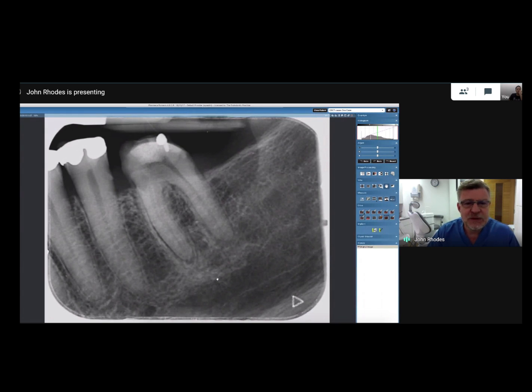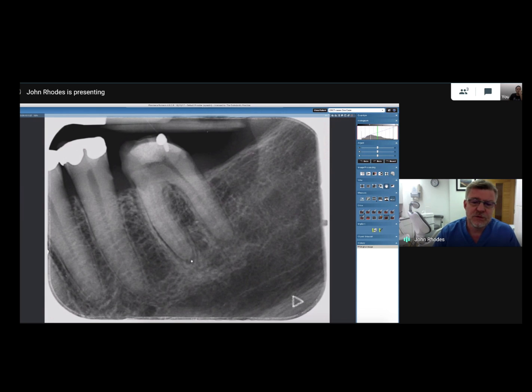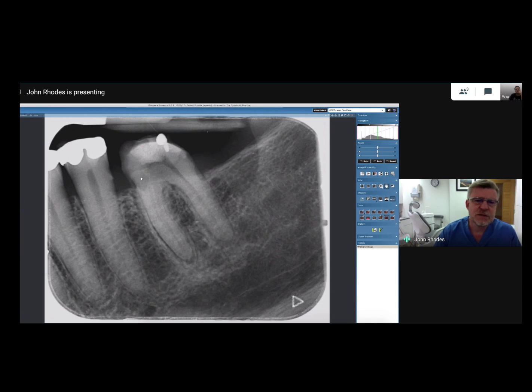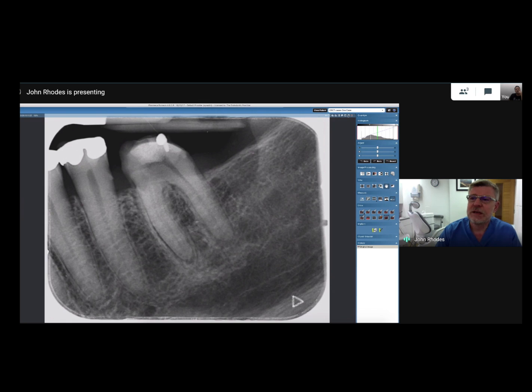So the mandibular left first molar has been referred for root canal treatment, and we can see there's periapical periodontitis here. But we're not quite sure what's going on — is there caries? And around the neck of the tooth there's another problem that sometimes occurs: external cervical resorption, which can mean the tooth isn't treatable. So we took a CBCT to assess this.